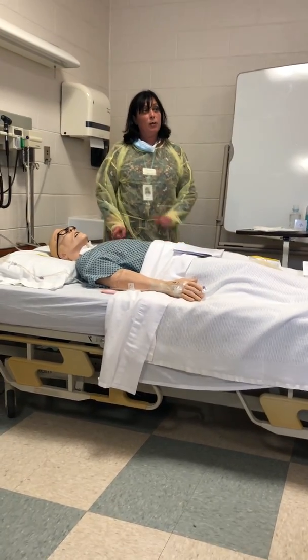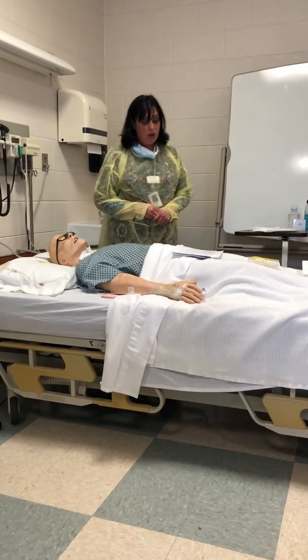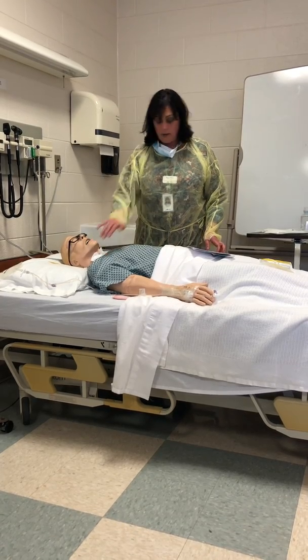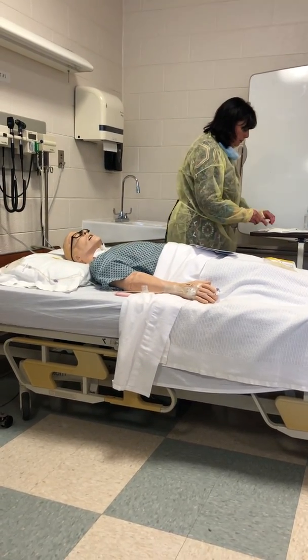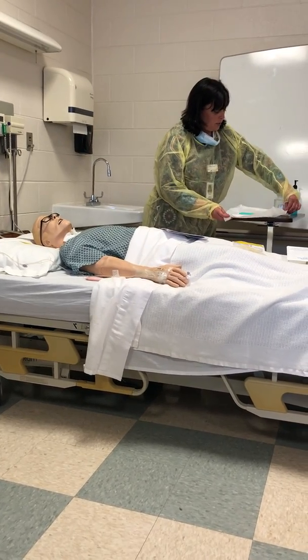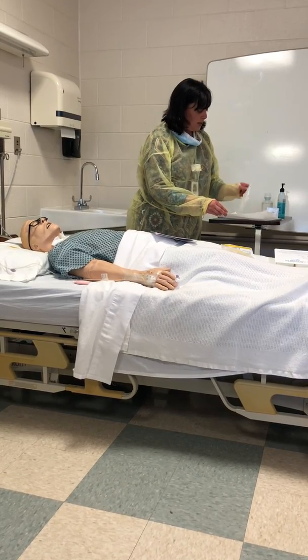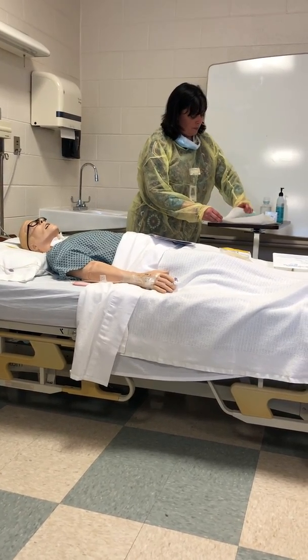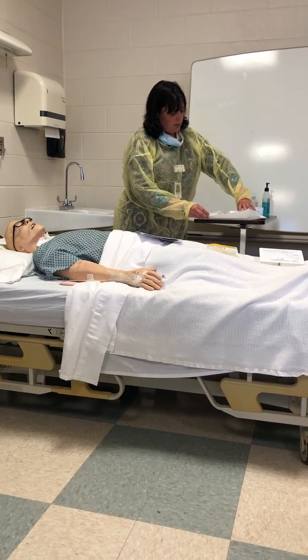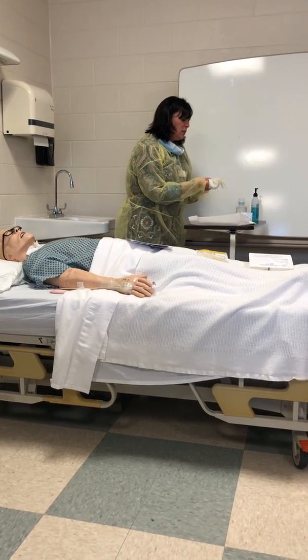Okay, so he's taking a couple of big deep breaths. Awesome. Okay, so we're gonna get ready to suction you out. Okay, you ready? All right. Where's my finger? I don't like these gloves, so I don't use them. Someone can if they like them. As long as I can get in there, that's great. Okay, these on. One hand's gonna become dirty.